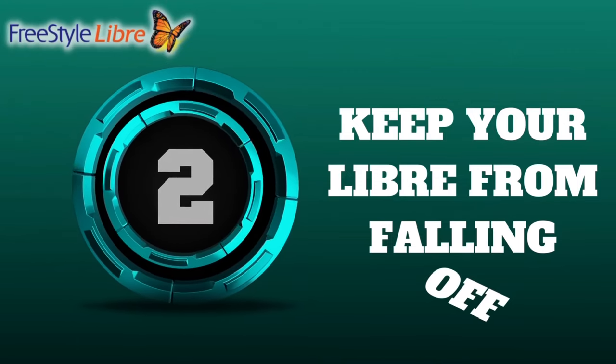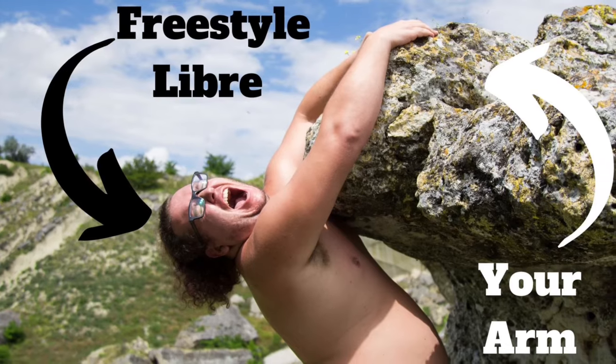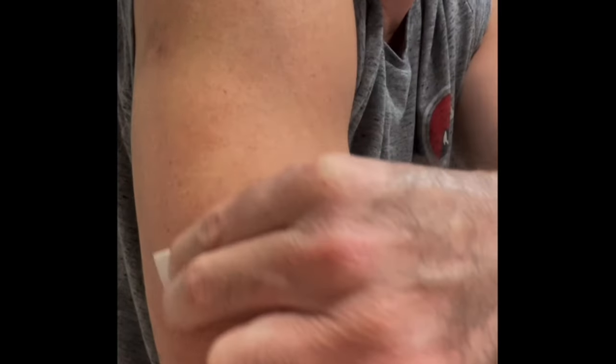Number two: keep your Libre from falling off. While I love the Freestyle Libre sensors, the one thing I don't love about them is their adhesive. Libre sensors are notorious for falling off before the full 14 days, but I do have a solution — something called Skintac. I always felt Skintac should be included in the box with the Libre sensor by default, as it's very much a necessity. Skintac comes in a couple of different varieties: a bottle or individual wipes, which is my personal preference. To apply Skintac, first clean the arm with alcohol as you normally would. Once the alcohol dries, apply the Skintac — it takes about 30 seconds to completely dry. Feel around the edges to make sure it's tacky, then apply the Libre sensor as you normally would. The Skintac applies an additional hypoallergenic layer of adhesive that cements the Libre in place and keeps it from falling off prematurely.